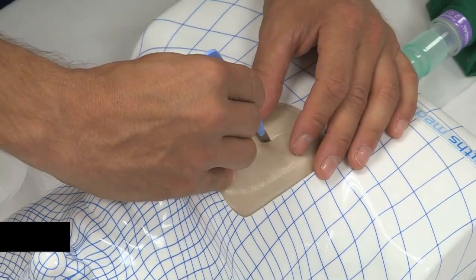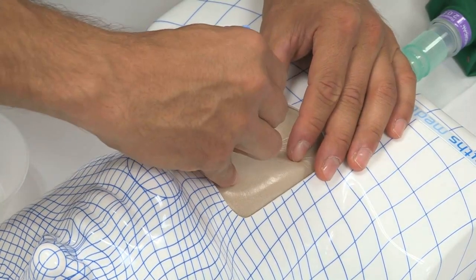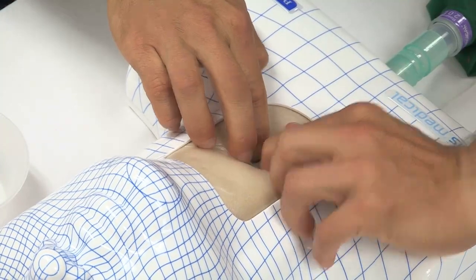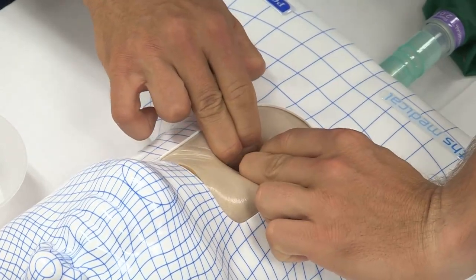For the finger-scalpel cannula technique to be successful, the midline incision should be at least 8 cm long if possible. An incision which is too small does not allow for optimal exposure and access to the airway and can lead to failure of the technique.